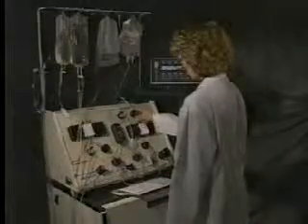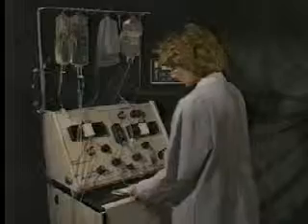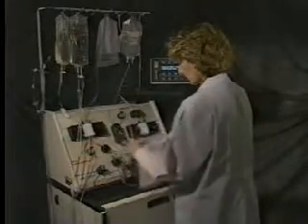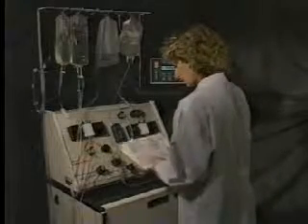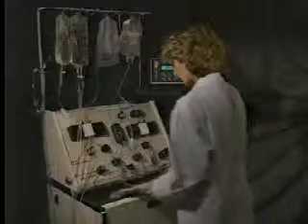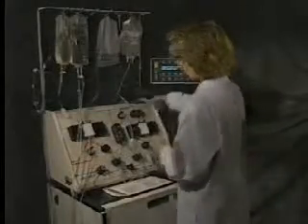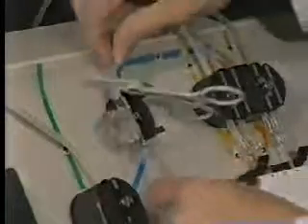If fluid is in the return line, you cannot simply remove the sensor and reseat it. Doing so causes the diaphragm to move out of its neutral position. We will now go through the steps to return the diaphragm to its neutral position. This procedure is covered in the Recovery Procedures section of your operator's manual and also in the troubleshooting chart of common prime alarms.